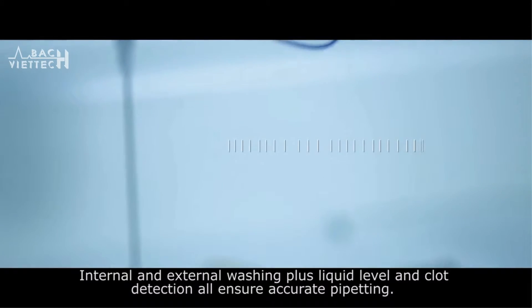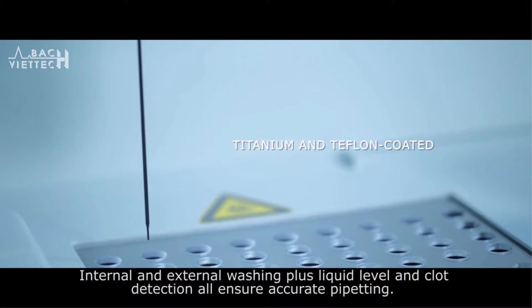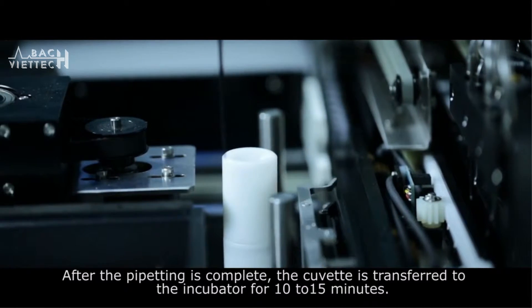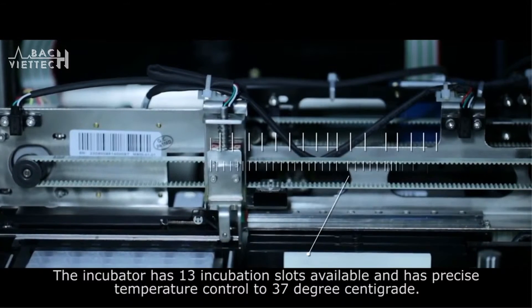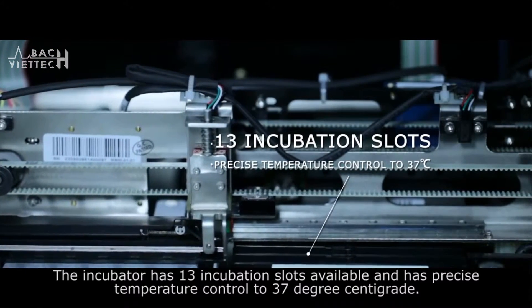Internal and external washing, plus liquid level and clot detection, all ensure accurate pipetting. After pipetting is complete, the cuvette is transferred to the incubator for 10 to 15 minutes. The incubator has 13 incubation slots and maintains precise temperature control at 37 degrees centigrade.